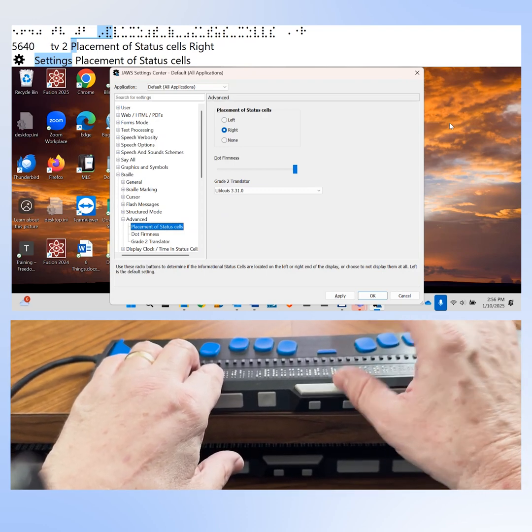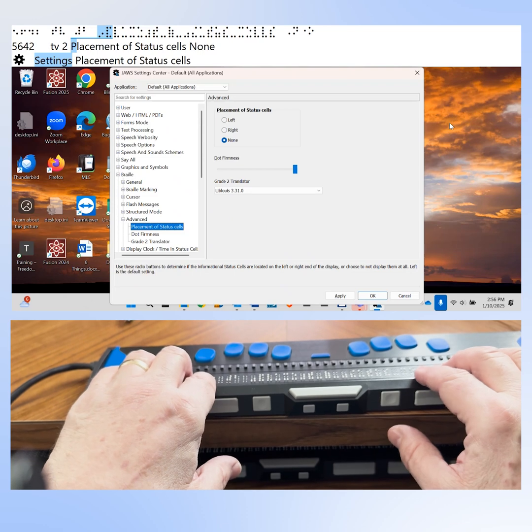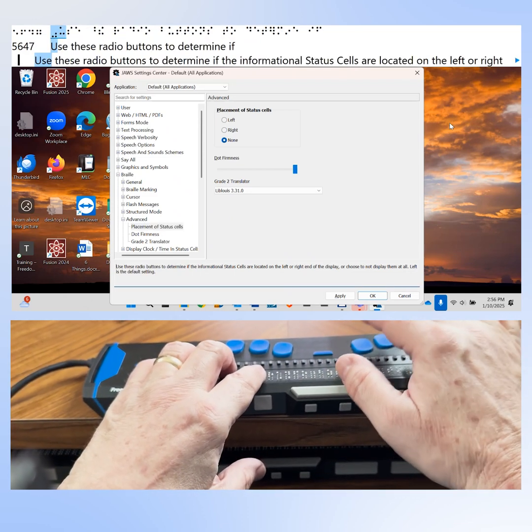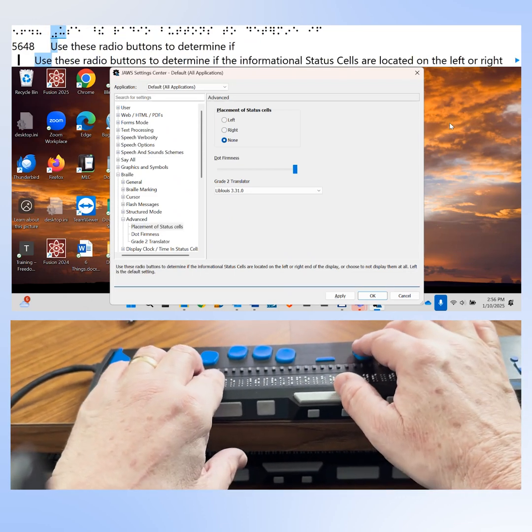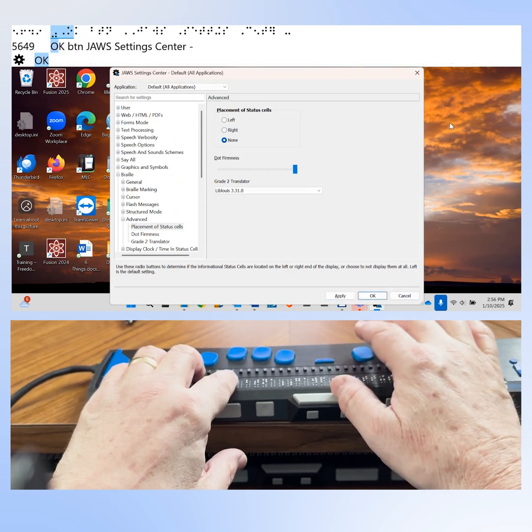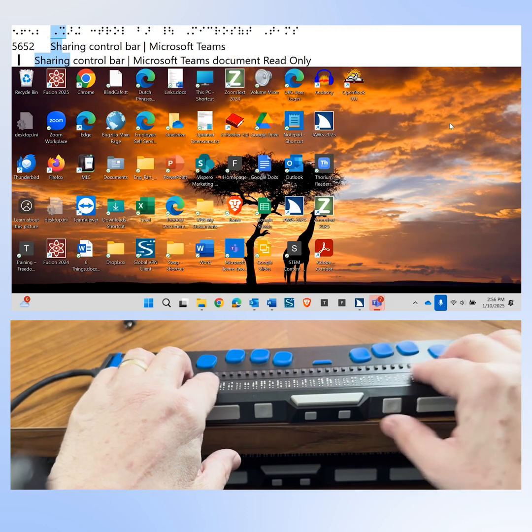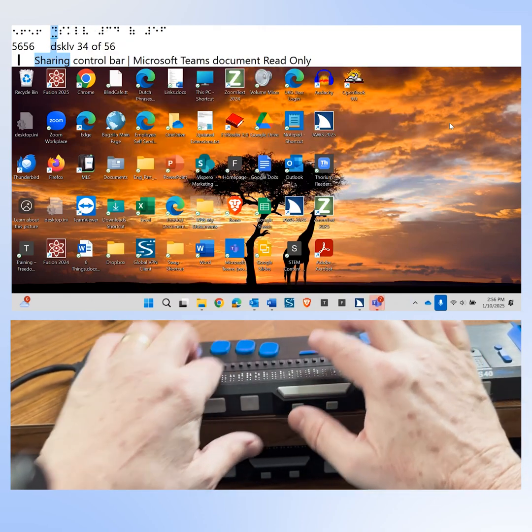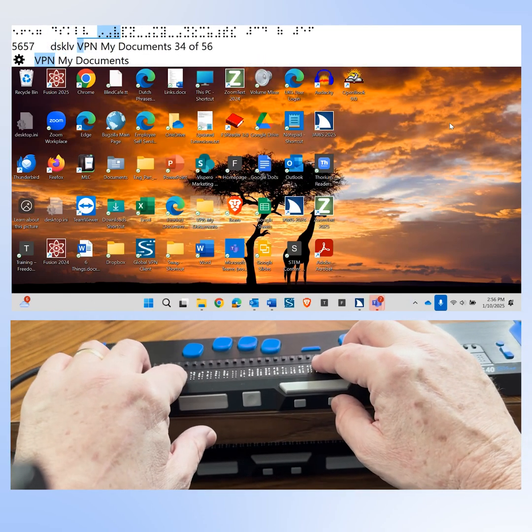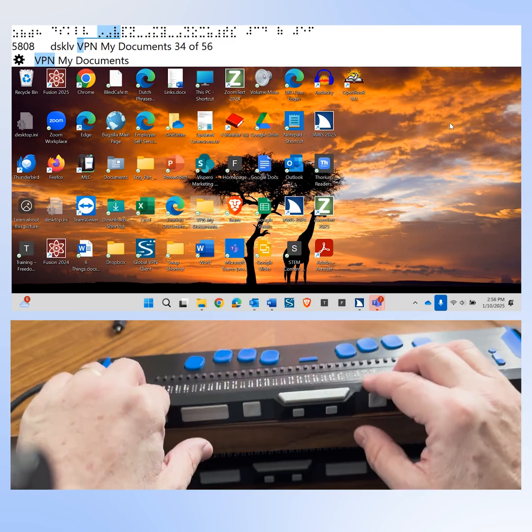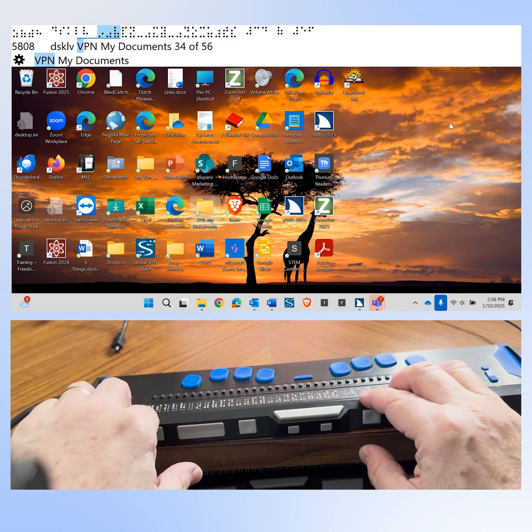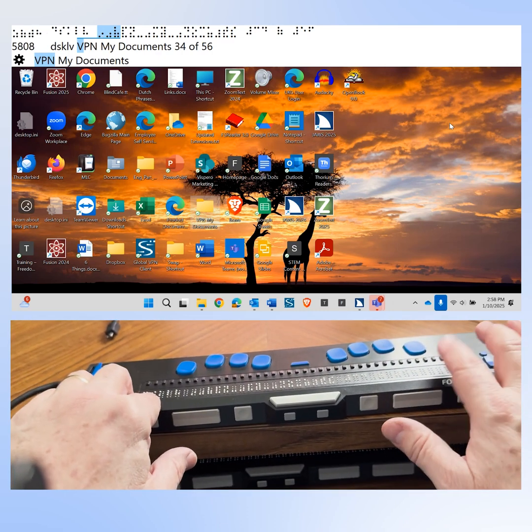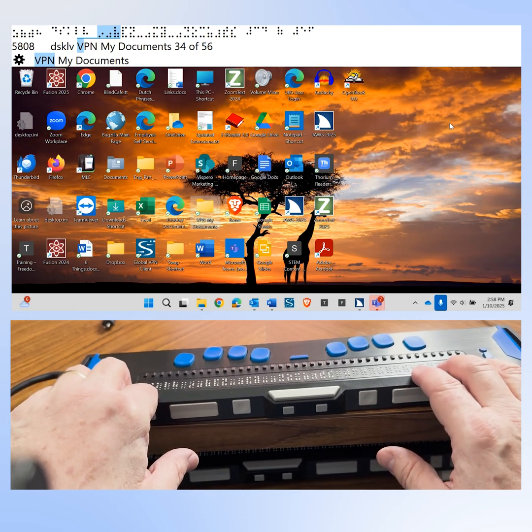And if you don't want status cells at all, press space one more time to select "None." Let's tab to the OK button and press space to apply. As you can see, the status cells no longer appear at the left end or the right end of my braille display. I have turned them off.